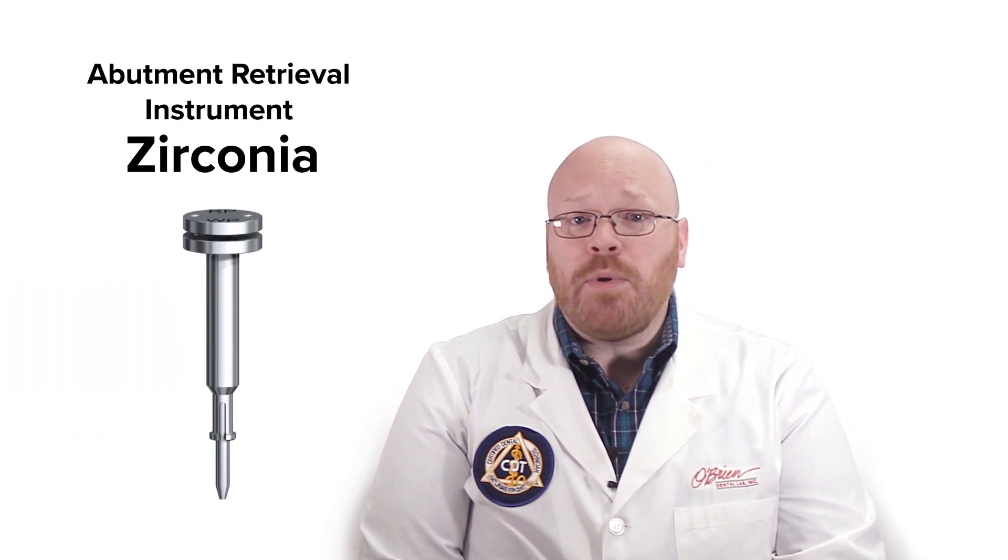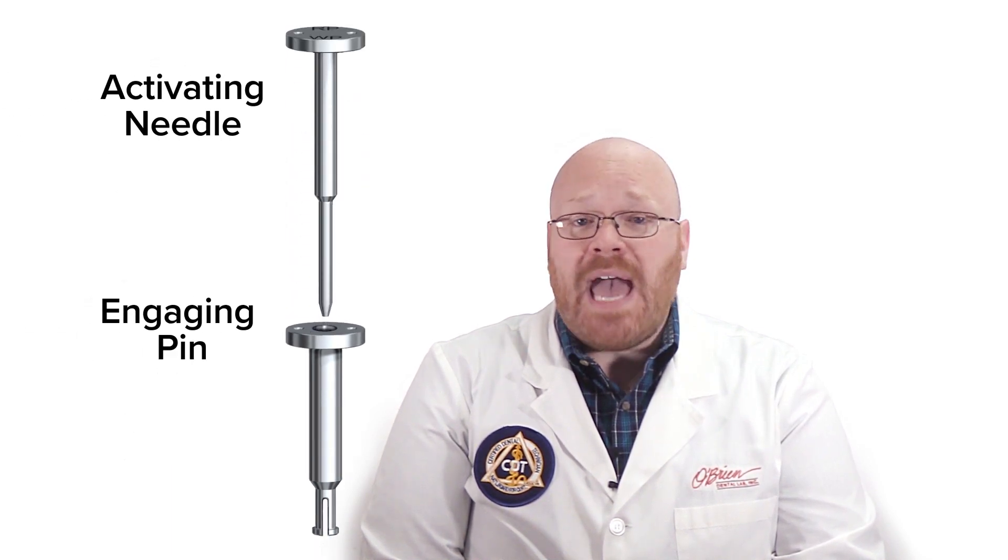The final tool is the Abutment Retrieval Instrument Zirconia, and it can be used for full zirconia abutments as well as the kind with the titanium base. This tool is a two-piece system comprised of the Engaging Pin and the Activating Needle. To use this tool, you'll separate the two pieces, then the Engaging Pin is inserted into the abutment until it reaches a stop. Next, the Activating Needle is inserted into the Engaging Pin and pushed down firmly until the top of the needle is flush with the top of the Engaging Pin.